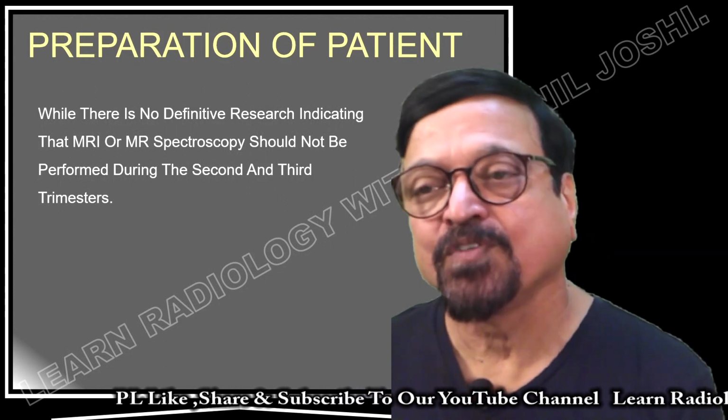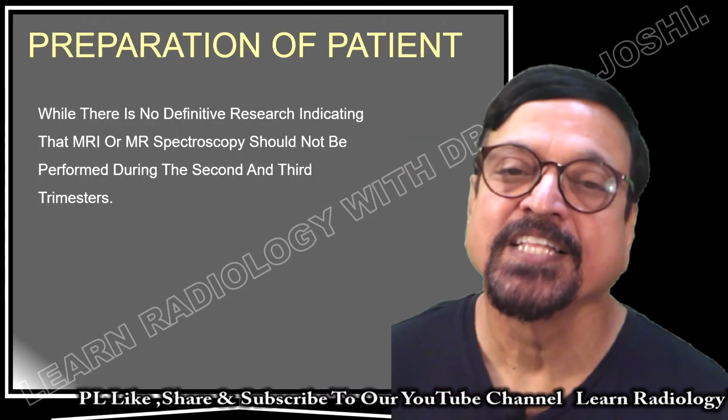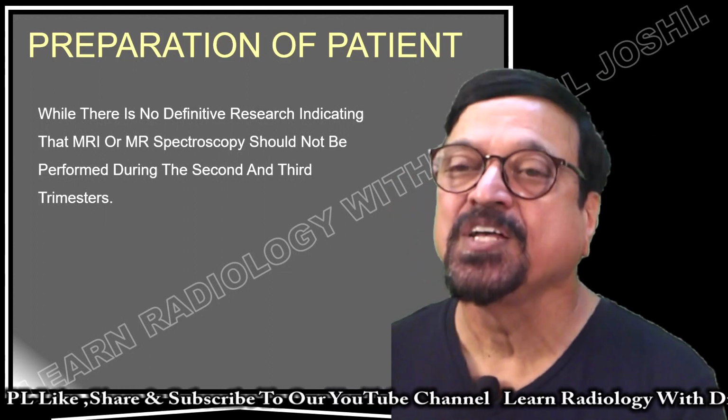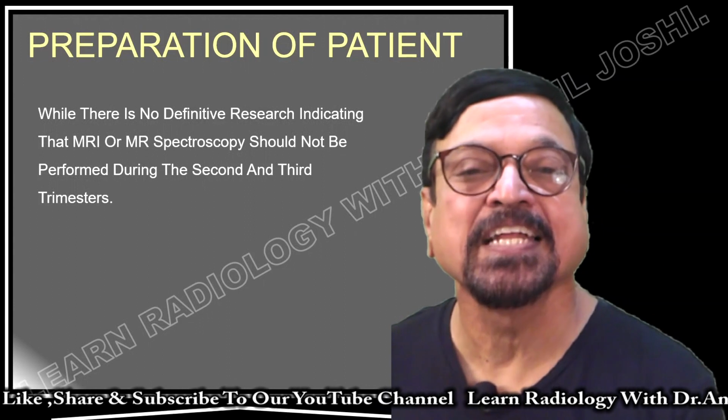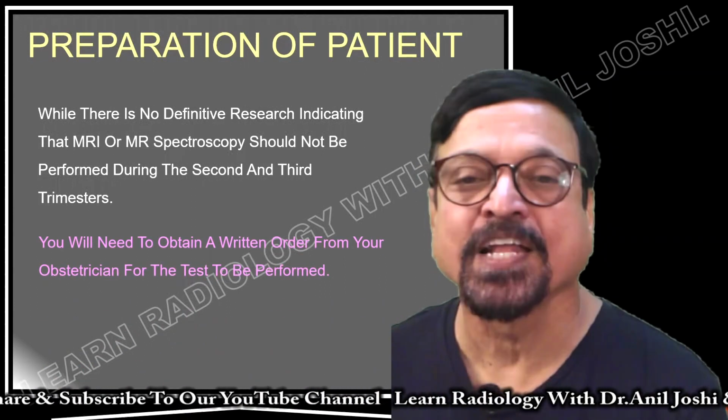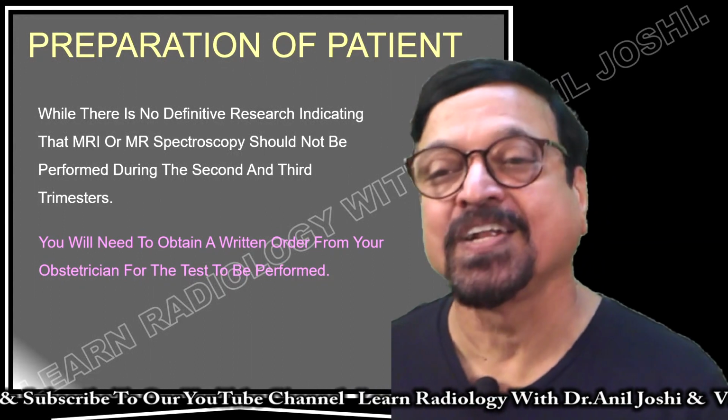MRI can be safely performed in the second and third trimester. There is no harm. Often it is one of the investigations of choice for an anomaly scan, which is done between 20 to 24 weeks. It can detect all anomalies excellently. Again, it's a topic of a different lecture.